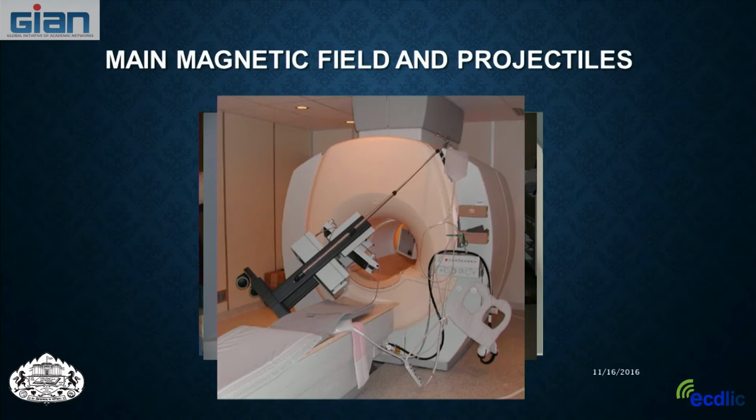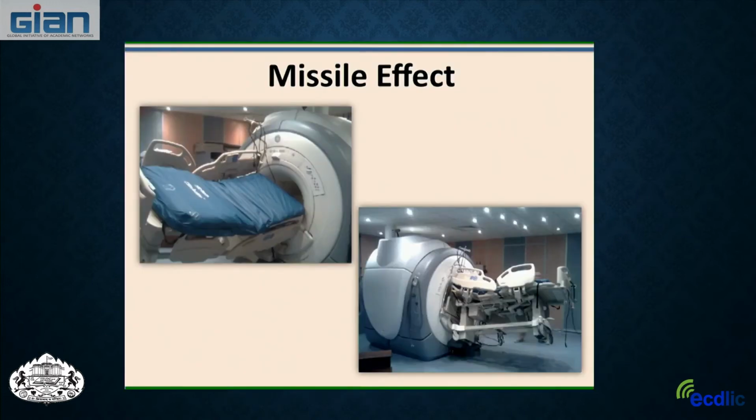Here somebody brought, looks like maybe an IV pole, into the magnet. You see how it gets stuck there and lodged in. These are cases of hospital beds, how they've been pulled into the magnet, and you can see it's just hanging here.